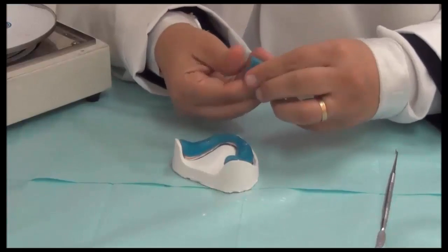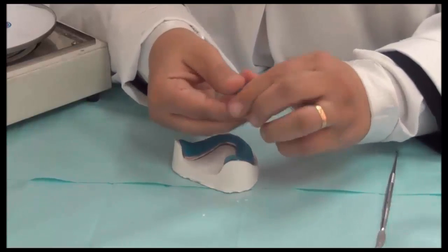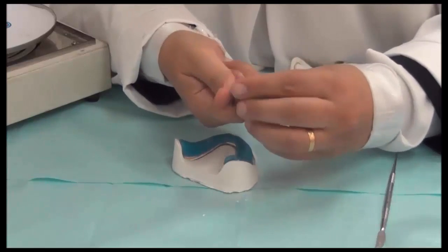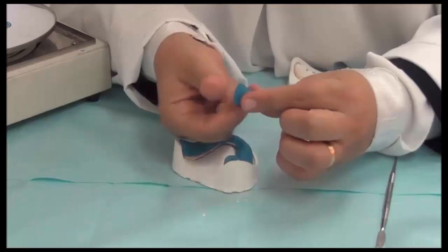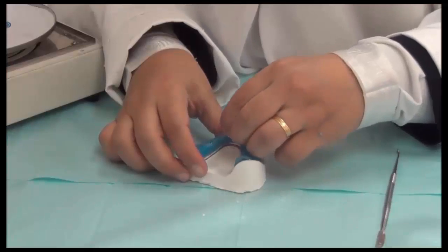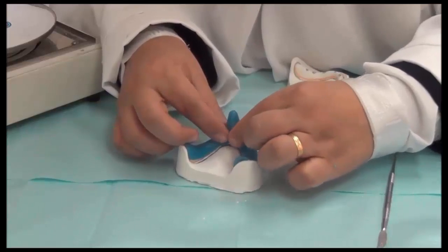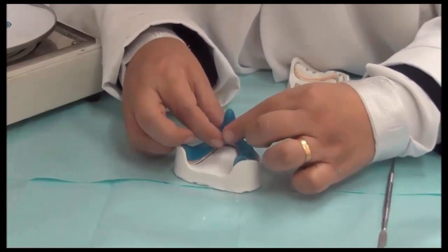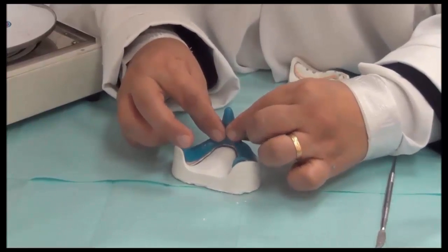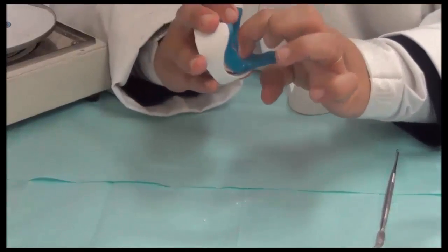So we formulate the handle. Once more, we form it in a roll shape first. Then we press our thumb and begin rotating it against our thumb. This will widen at the base area and thin the outer area. In the base, we place a groove, and this groove can adapt to the cast. In the case of the lower, the tray itself is thin in the interior margin area, so we need to make sure that the handle is not bulky over this area. Once more, we adapt it well to the tray.